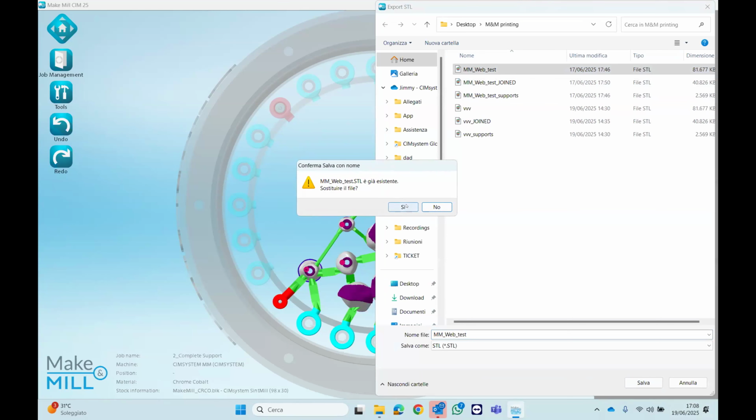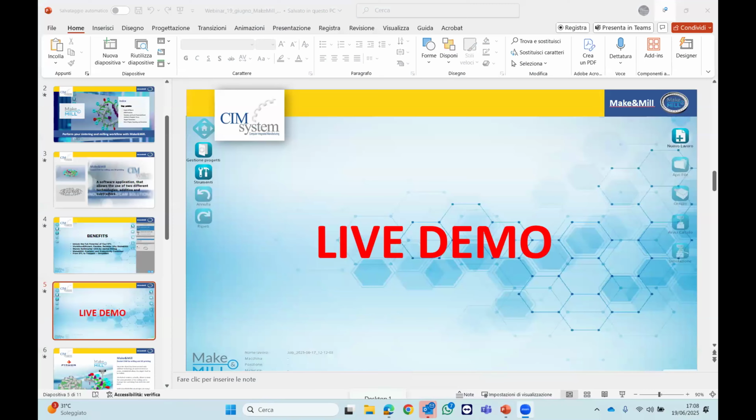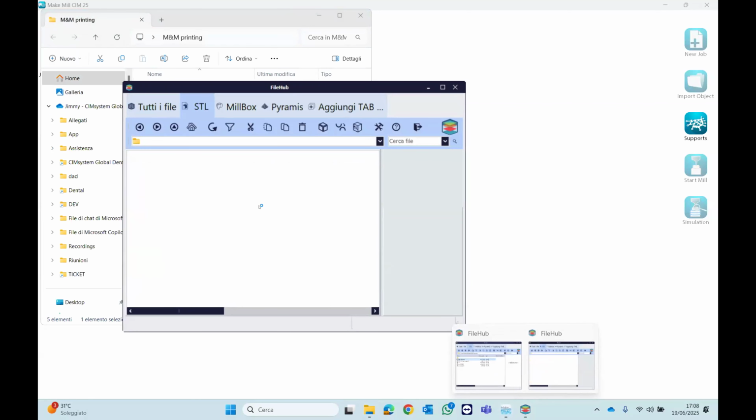If I click on one, excuse me, let's do it like this. I should have one. I was hoping not to make you lose all this time on this part, but we have to go here and I know I have one here somewhere. Okay, I go here, now open. Just give it a second.